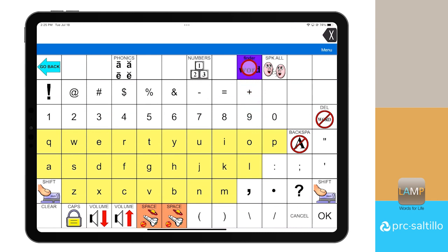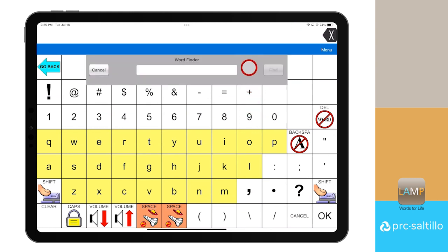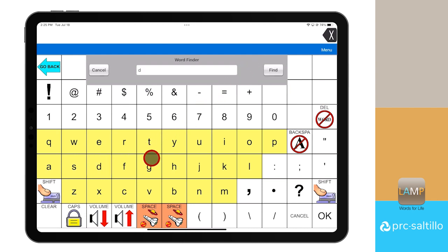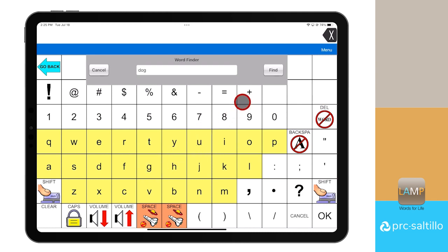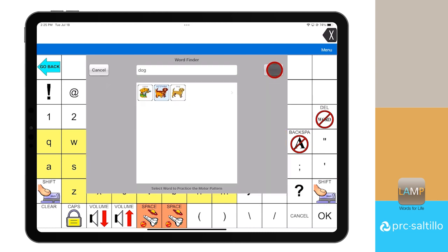You can then spell the word you want to find directly on the keyboard page. In this example, we will look for the word dog. Once you are done spelling your word, select find next to the search bar.